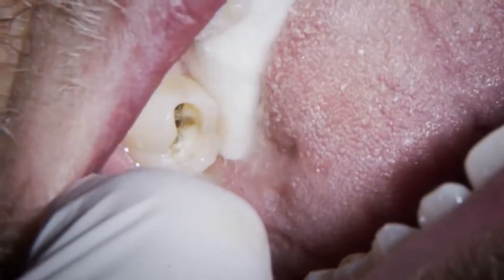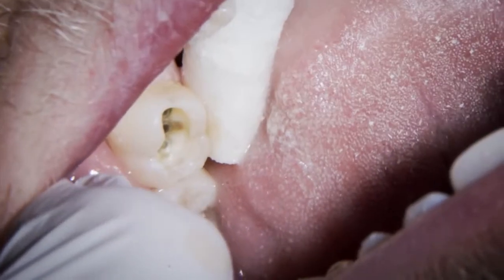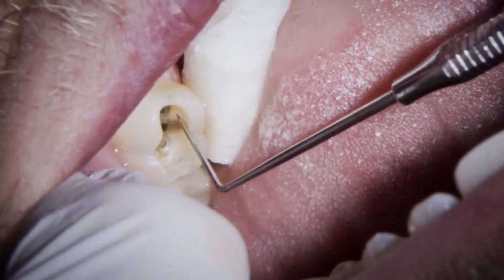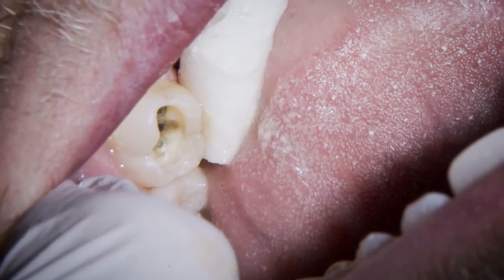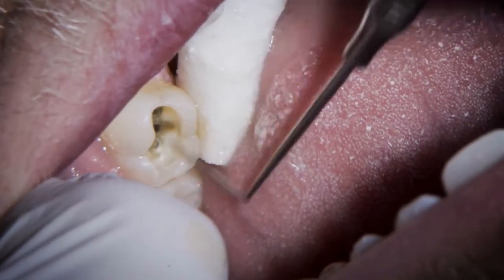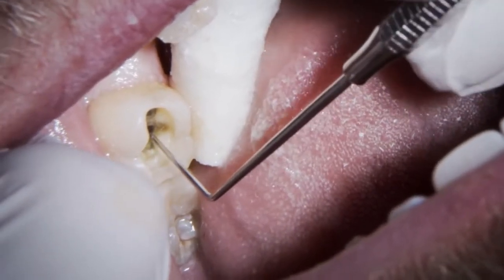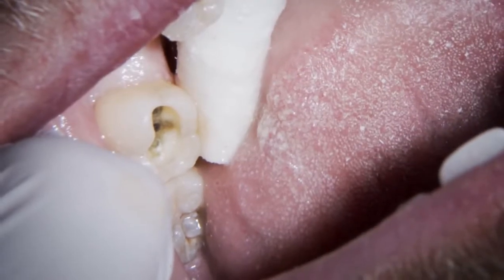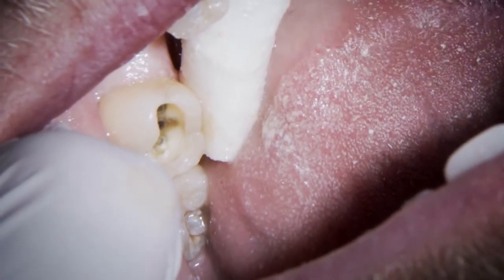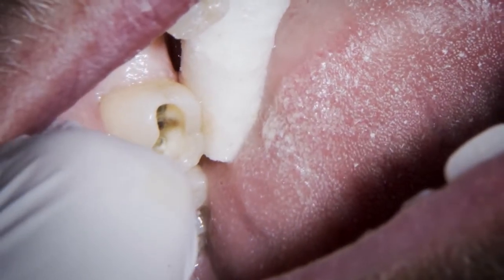Having used biodentine for many years now, you just get so much confidence with it as a material. We know that if we get a good seal and there's any active caries, it's going to bring it to a standstill. And once it's had time to really build up those links with the natural dentine, it's going to really strengthen that internal structure. The best thing is there's just no irritation to the pulp whatsoever. Biodentine absolutely comes into its own as we get closer to the pulp, letting it settle naturally with virtually no irritation after the fillings have been placed.